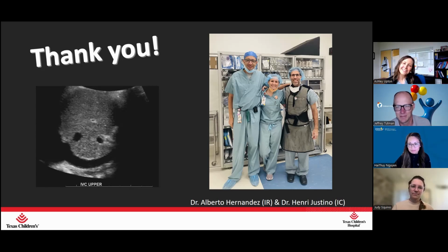I want to get the most consistent and the most reliable samples. So I'm looking at the color to make sure I'm sampling where it's most appropriate. I do know that liver disease is not always homogeneous. And so I think that's also a struggle with some of these patients, especially with cirrhosis and fibrosis. It's hard, but I'll get the most consistent color. And so hopefully those numbers will be somewhat close together and less than that 15% or 30%.